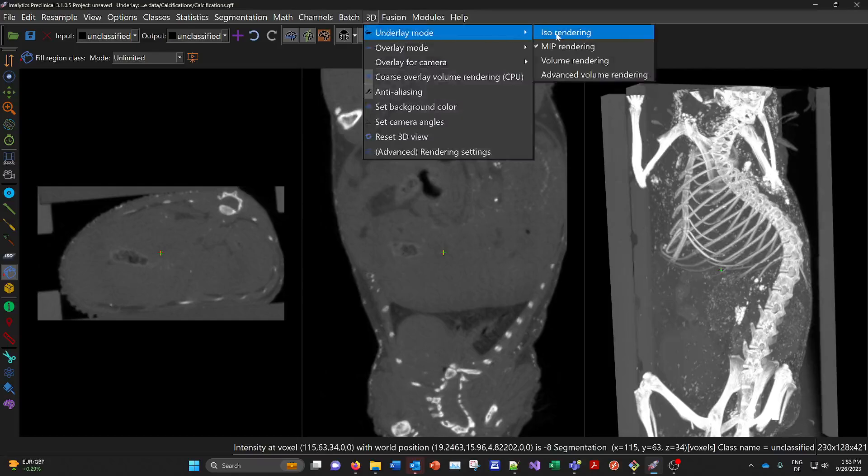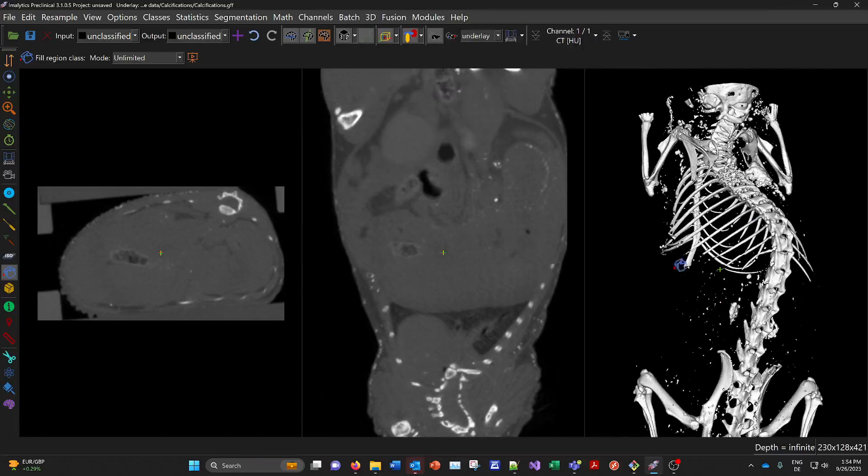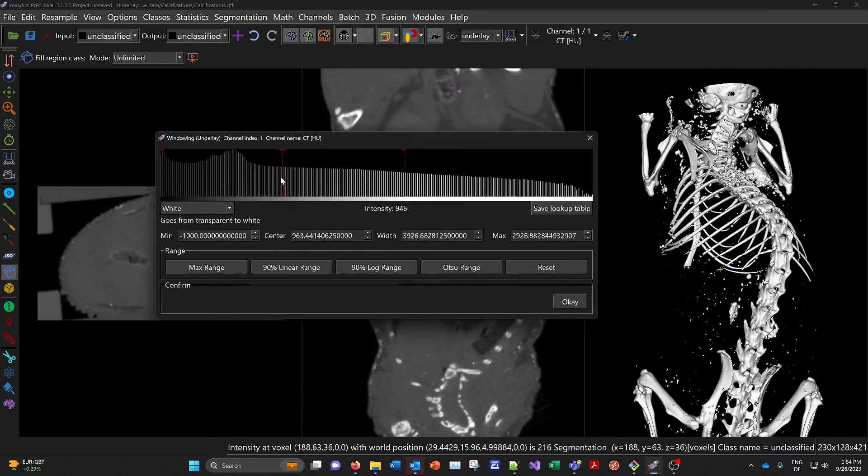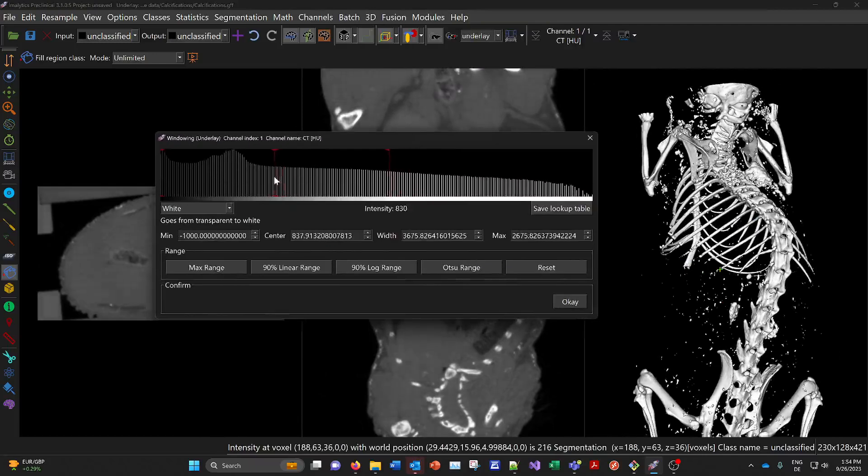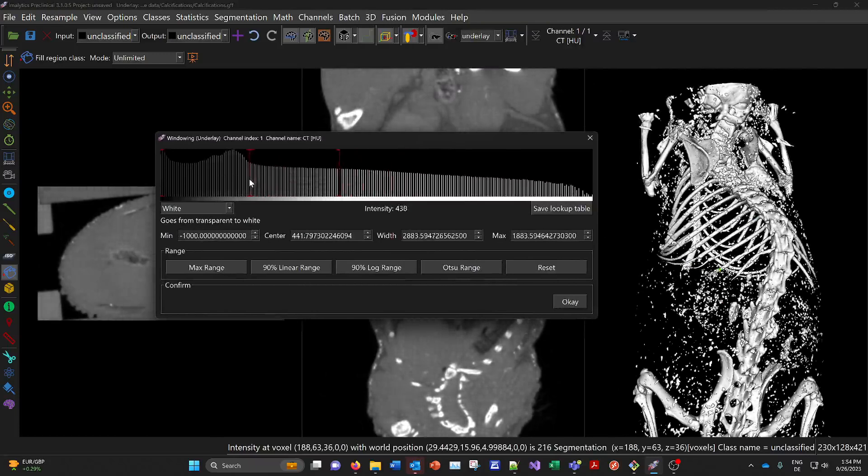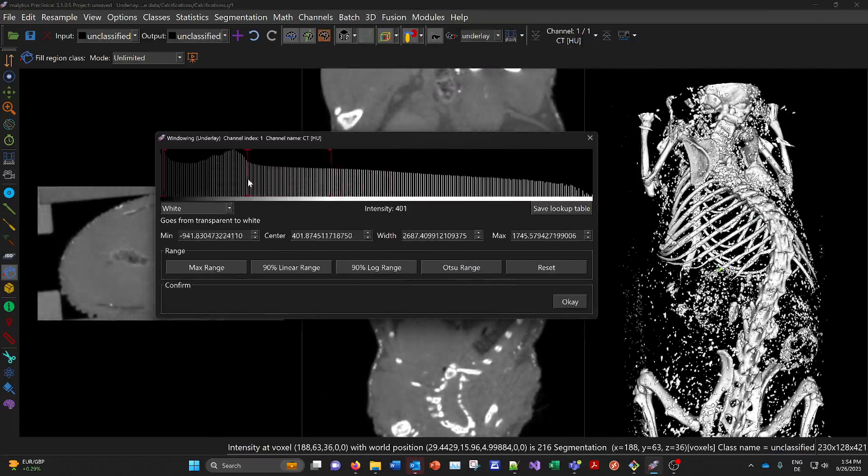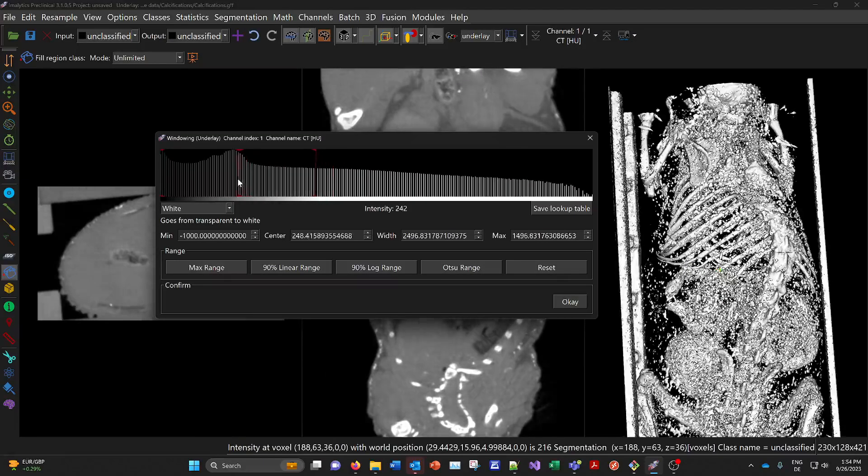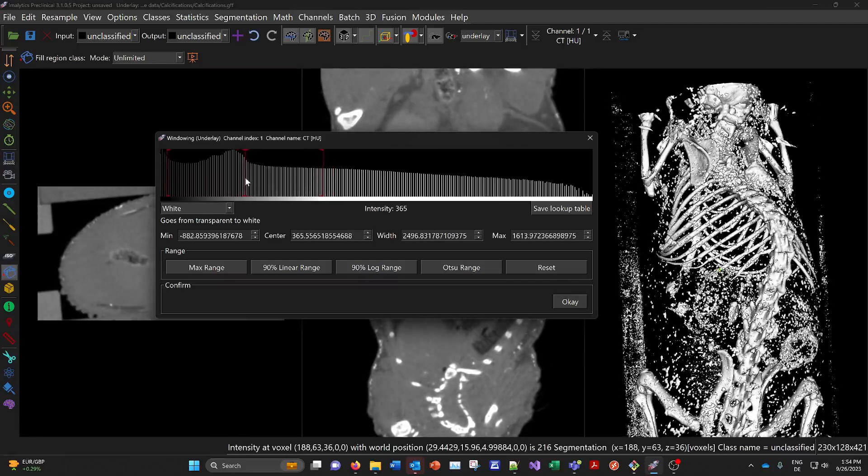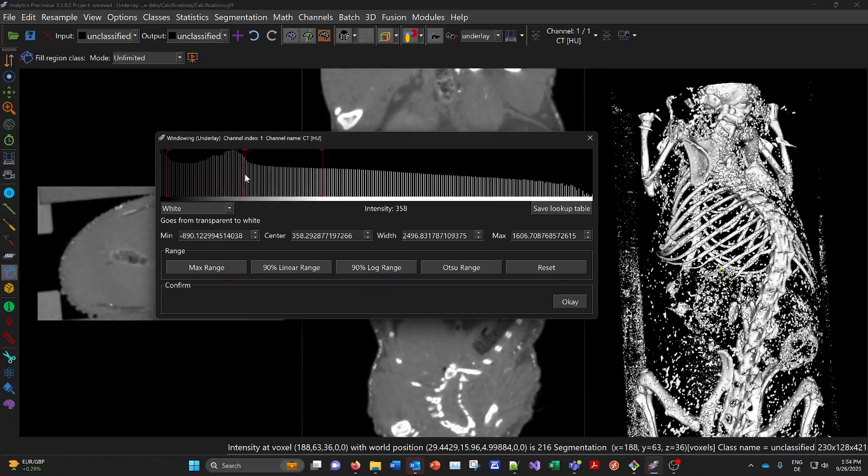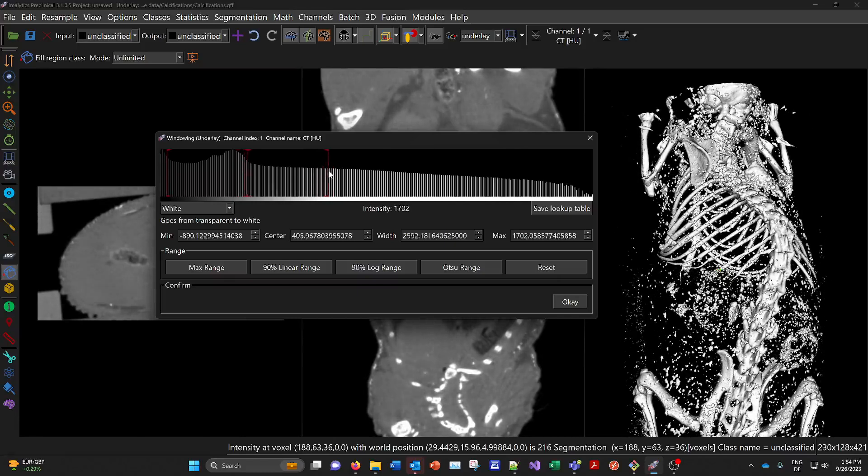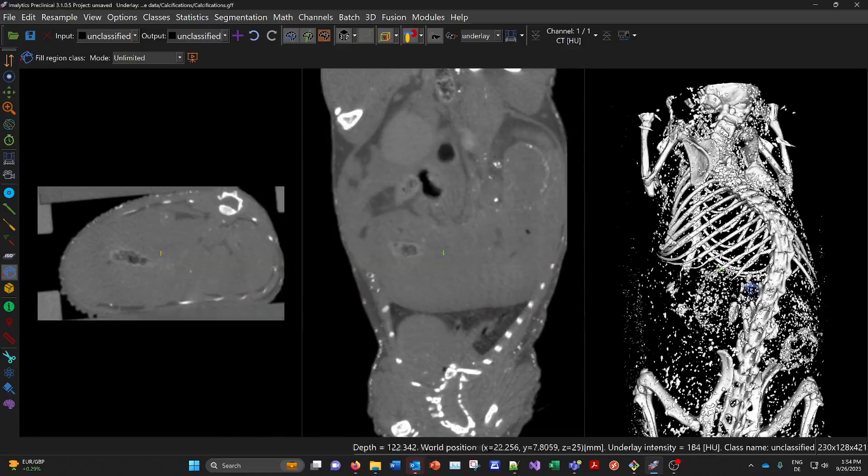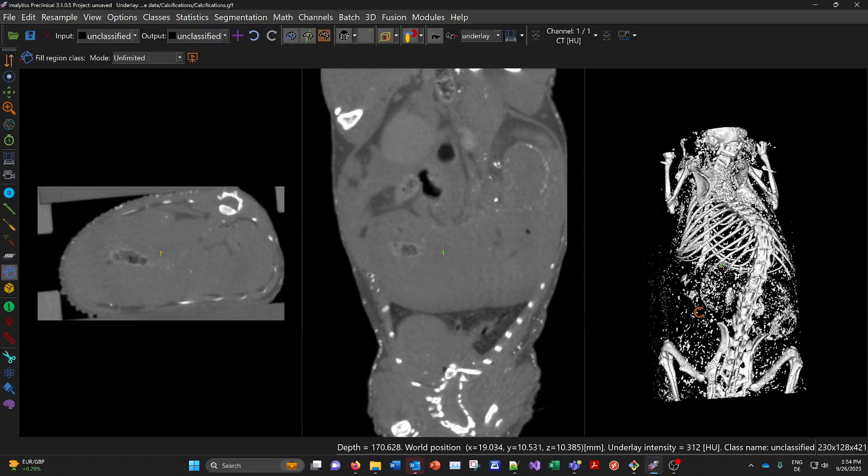Let's go back to this ISO rendering because this helps to find a good threshold. And we basically should go as low as possible just not to the point where we get the soft tissue. So maybe something like this here. So maybe a threshold of maybe 400. Let's keep that threshold in mind.